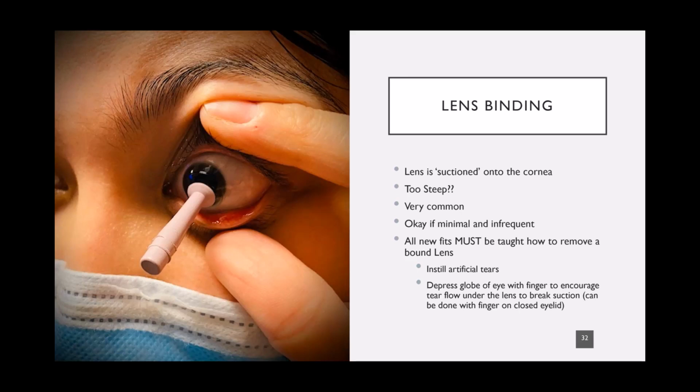So as long as they know that it's super common and it will probably happen to them at some point in time, and to remain calm and how to deal with it, that's just going to make you look like more of an expert in their eyes. It's going to keep them calm. They're going to have more faith and more trust in you.